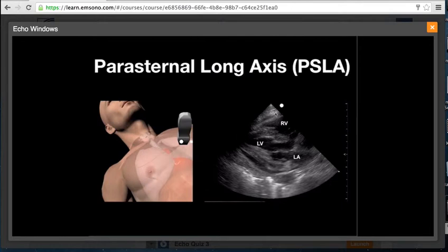Here we've got the following image then, and this is from the cardiologist's perspective. You've got anterior, posterior, foot, and head. This is an opposite long axis imaging perspective from when we scan in the abdomen, but imagine that you're looking at the heart from the patient's left side. So you've got the right ventricle here, left ventricle, left atrium. You've got the aortic outflow tract here. Here you've got the descending aorta. And this patient has a small pericardial effusion, and you can see that it goes in between the back wall of the heart and it's anterior to the descending aorta.